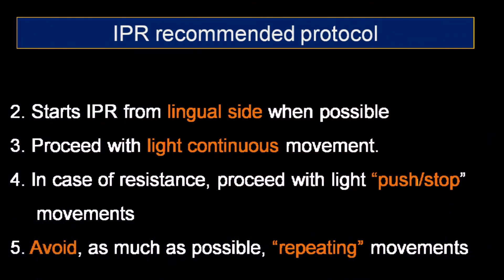Now I will speak about my technique for interproximal reduction, which I found to be a very safe, efficient, and controlled way to perform interproximal reduction. The contact points of the teeth are usually more to the lingual side, so it is better to start IPR from the lingual side when possible. Proceed with a light continuous movement with the burr. If there is resistance, it is best to proceed with light push-stop movements. It is best to try to avoid as much as possible repeating the buccal-lingual movements.